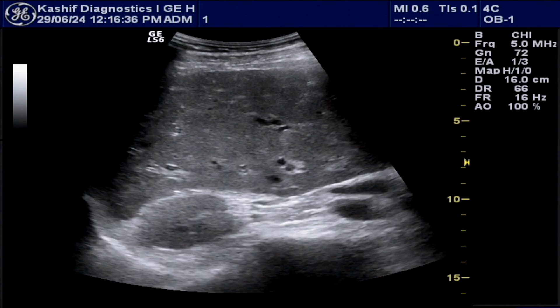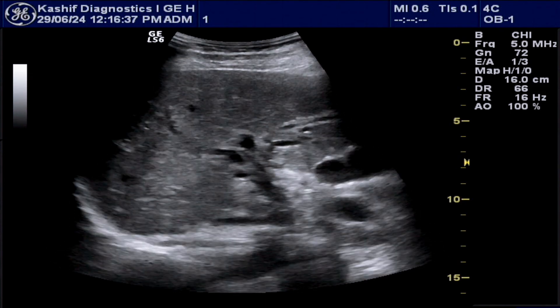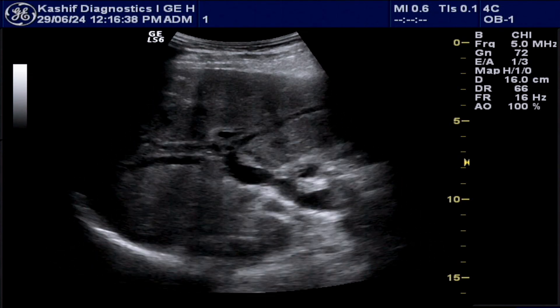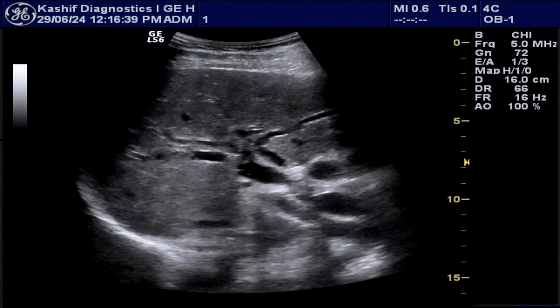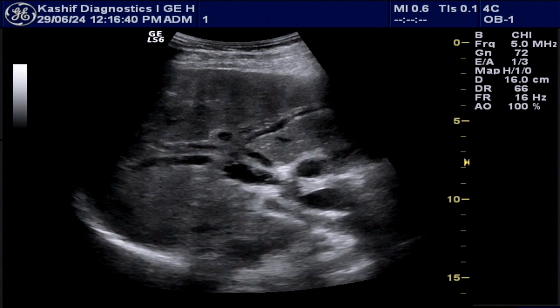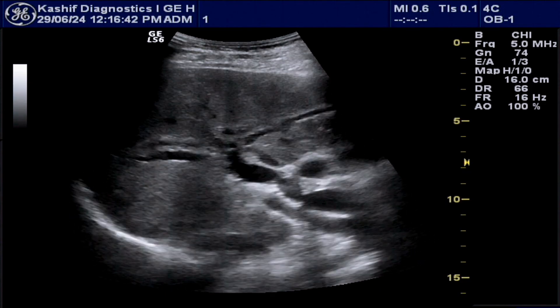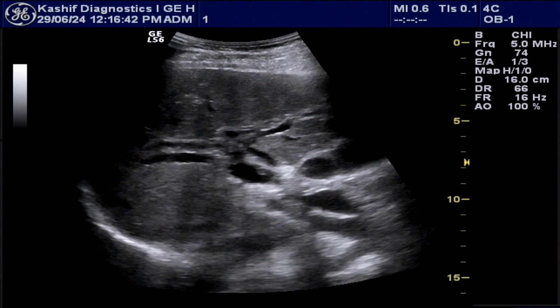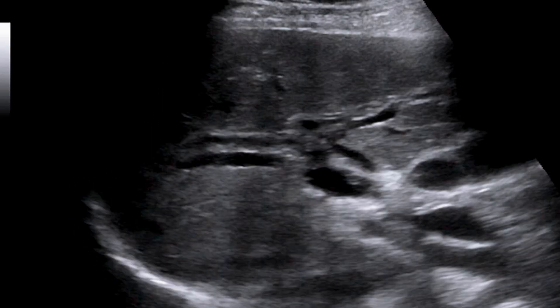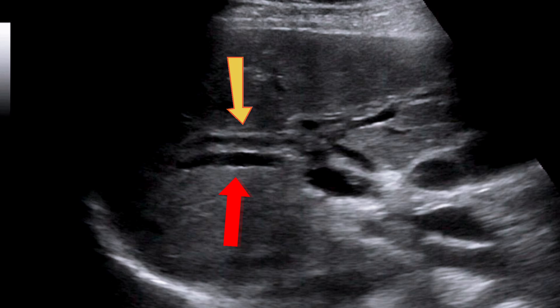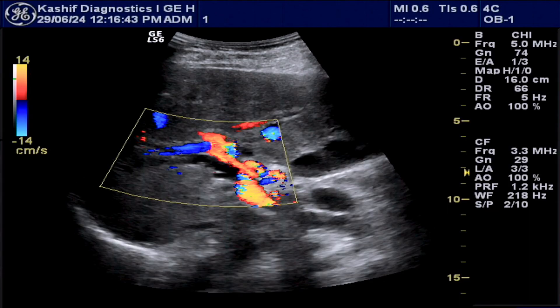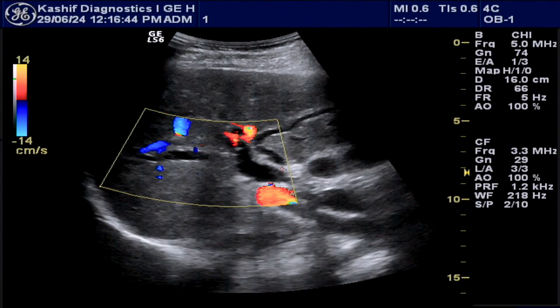This is the liver. As we see, liver echo density, texture, and surface is normal. But what are these tubular structures in the liver? The anterior one is the portal vein, and the posterior one is the dilated intra-hepatic biliary ducts.